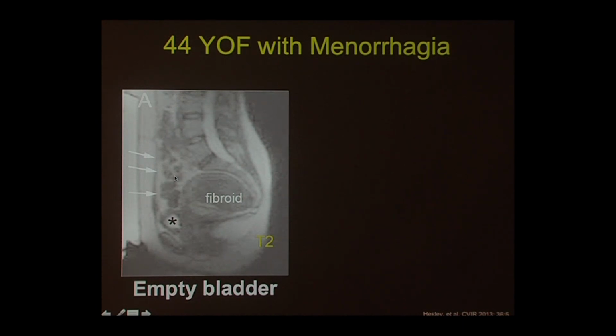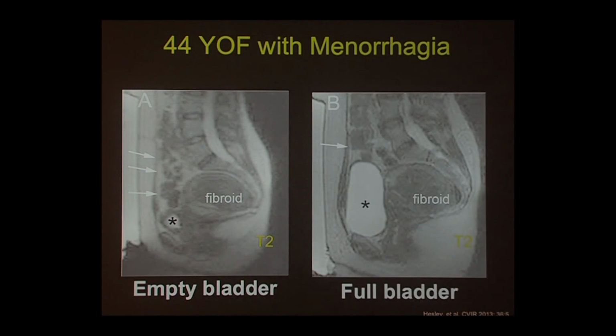So we like to avoid situations like that, and as a result, we have a catheter in the bladder, so why not infuse some saline and raise the bowel out of the way, in which case I can just burn through the bladder, which is totally fine because of all the liquid in it, and prevent any injury to the intestine. And this explains why the procedure can take several hours, because a lot of it is patient preparation.